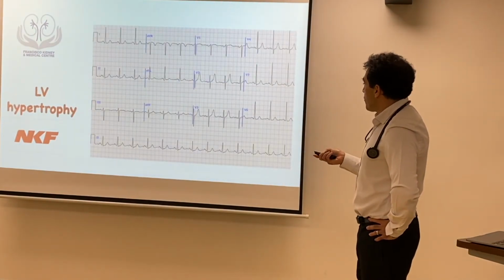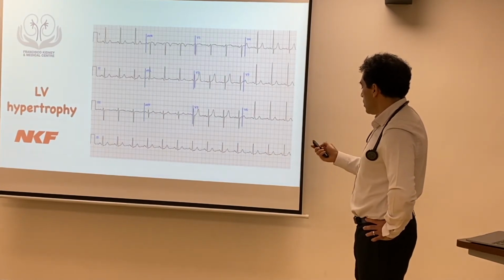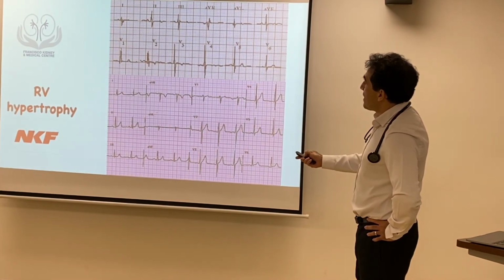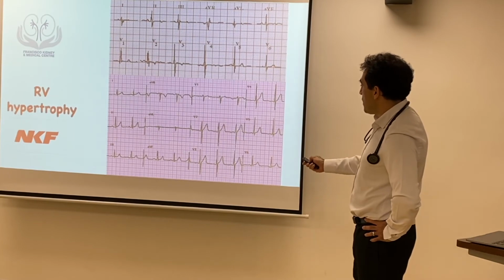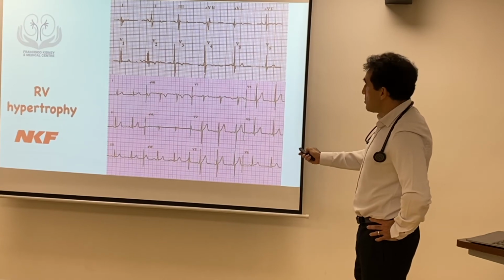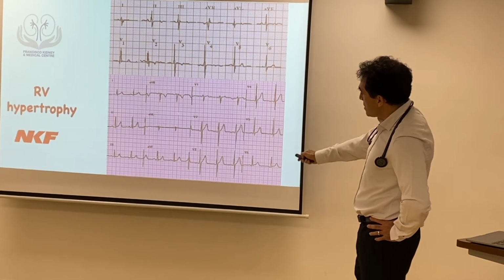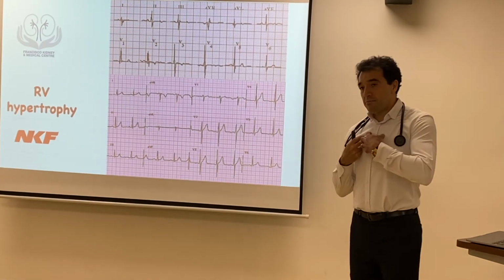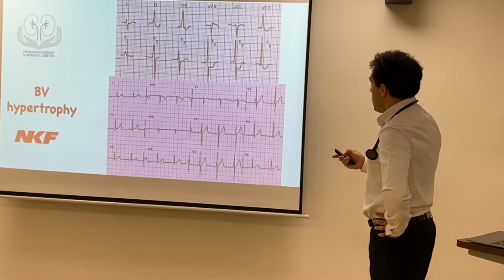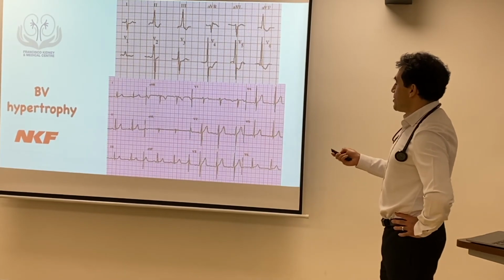Left ventricular hypertrophy, we already mentioned a little bit, you know, the R waves are quite tall. Right ventricular hypertrophy seems to be that the R waves start getting taller much earlier. You see, for example, in here, the R is very small, but here it's already quite big. It's because now the right side of the heart is bigger, and it's mainly seen by these leads on the right. So that's why. There can be ventricular hypertrophy in both, so you find changes from both, yeah.